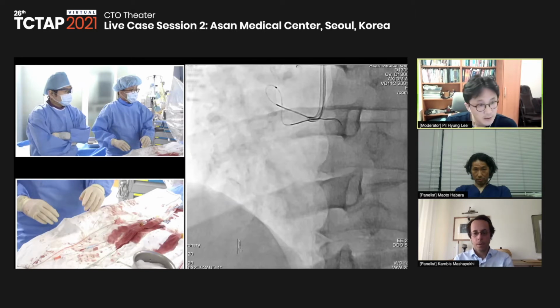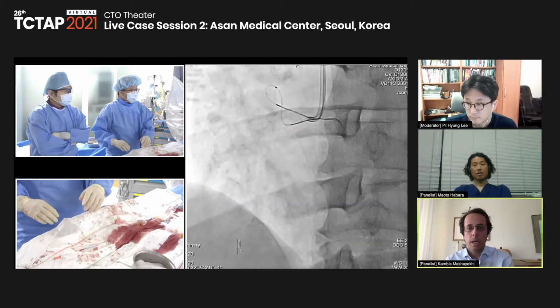Will we have some space for the ADR for this case? Well, first of all, I think it's absolutely important to do a correct puncture at the proximal cap. So therefore, we have to think, do we have a CT co-registration possibility in the lab? If yes, maybe we can even say we make a puncture without IVUS, but it would be very great to put the IVUS probe there and do a really controlled puncture with the IVUS.